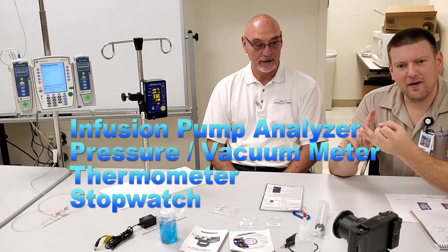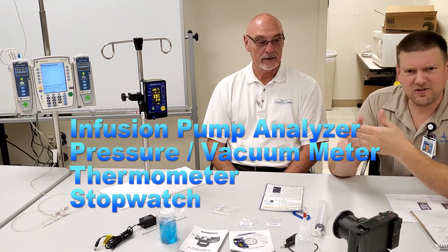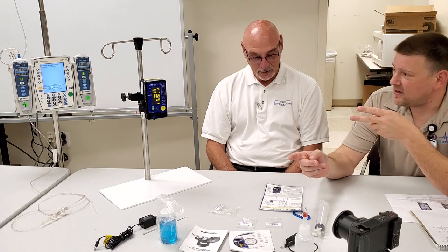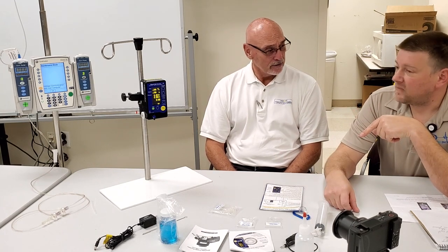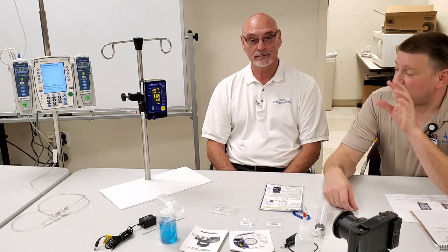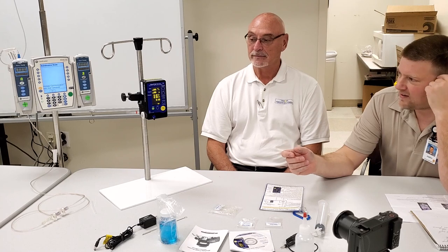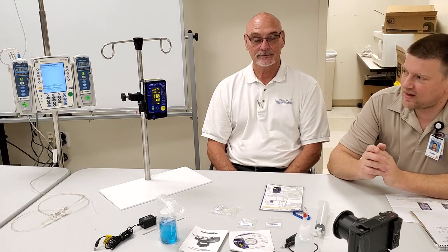The Flow Trax is an infusion pump analyzer, a manometer, a pressure meter, a temperature gauge, and a stopwatch — that's four different things in one little product. It's battery operated on two double-A batteries with a run time of about eight to ten hours. It also has an embedded accelerometer so it knows if it's tilted and it knows its positioning.